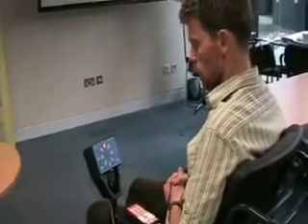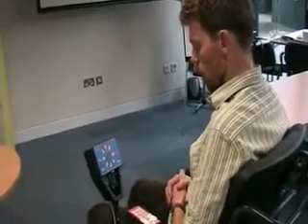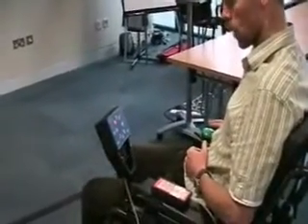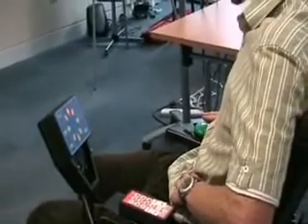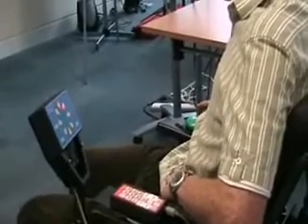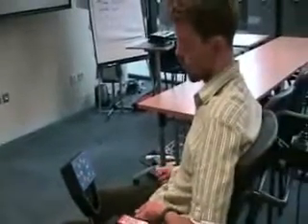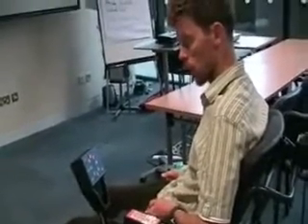Other scanning options or operating modes would be a single switch short click, which is a short click to advance the scan and a long click to select the scan. Other options are a two switch step scan, where one switch advances the scan and the other switch selects the scan.